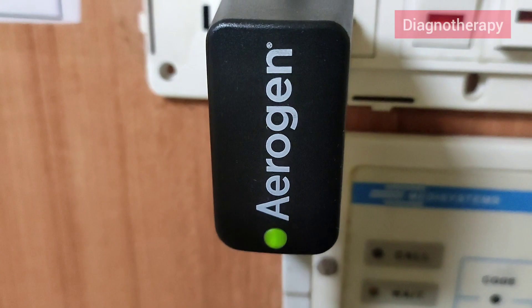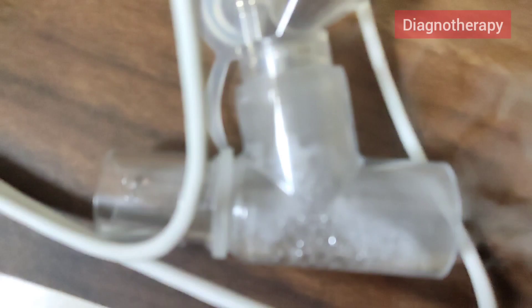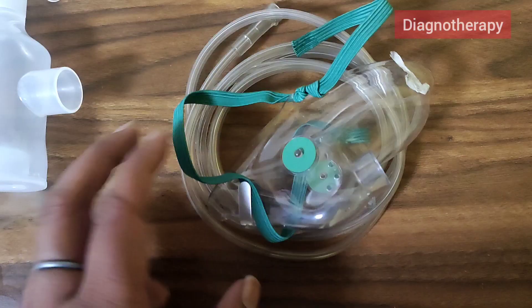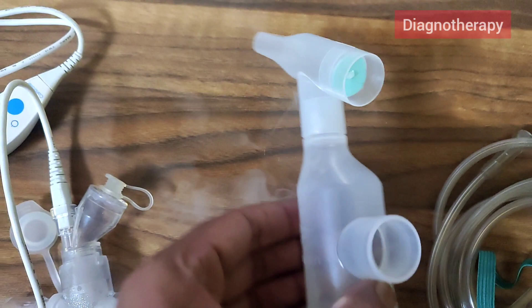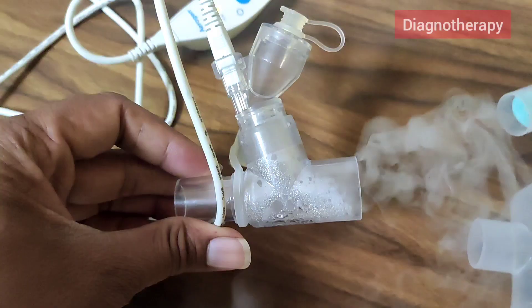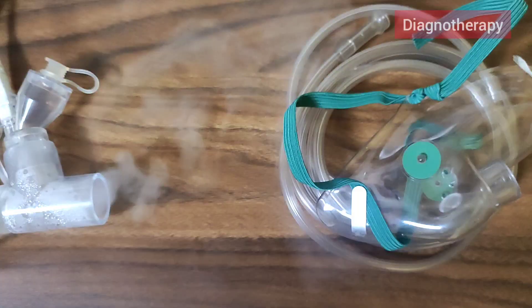Now we will be seeing a few accessories of this nebulizer. It can be used through a mask or directly from the mouth with this attachment. In the back, there is one attachment for oxygen, and this is the intermediate connector if the patient is on a ventilator or if any other attachment is needed. The delivery of medication through this principle is very effective, as there is a very dense fume and no change in temperature when the liquid converts into aerosol.